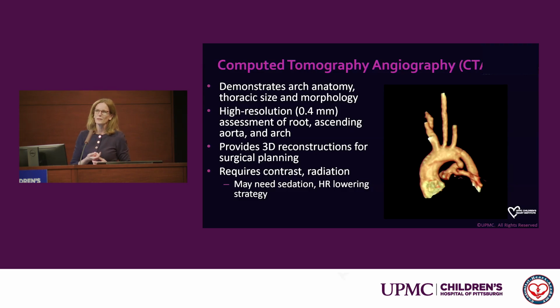When you think about imaging strategically, if you're imaging on, as we were about a year and a half ago, a 64-channel CT scanner, that would have required 4 or 6 heartbeats worth of data to get a nice gated CTA of the chest.